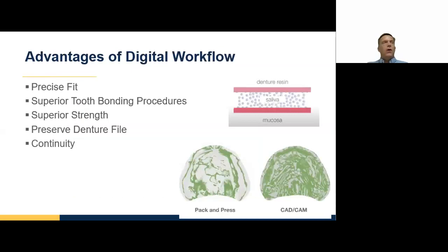Digital dentures are, I'd say, fairly new, the last couple of years, something like that. One of the challenges with traditional acrylics is that they shrink during curing, 8%. There have been a variety of different methods like injection and post-dams to compensate for the shrinkage. But if we think about denture retention, we haven't talked about suction, but what it really is, is fit. The saliva seals the small gap between the denture and the tissue, allowing it to stay in.